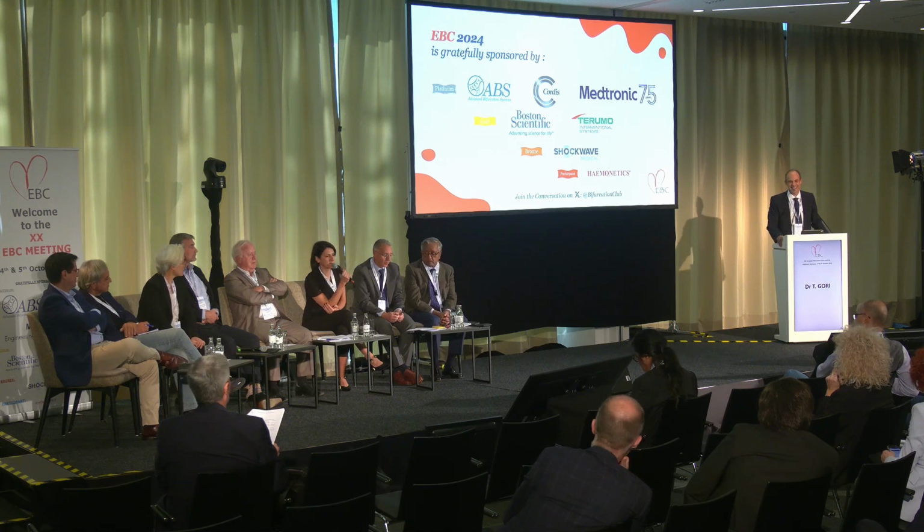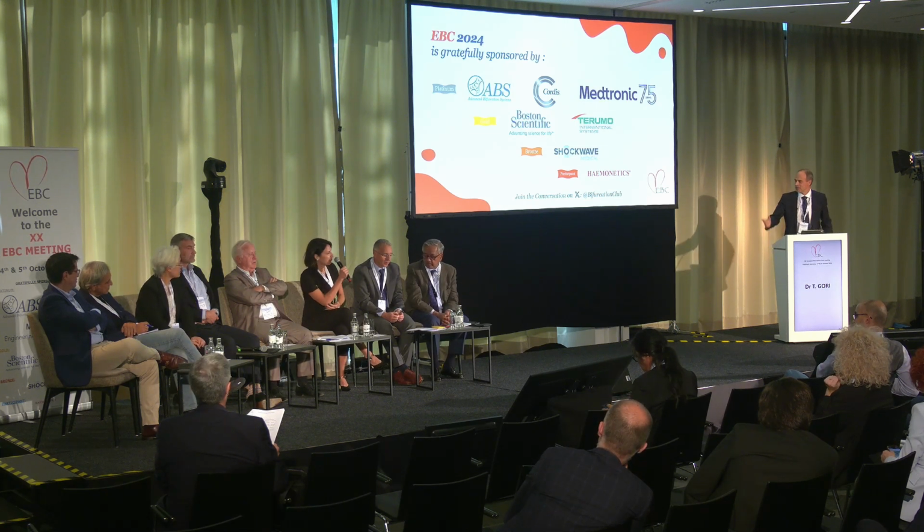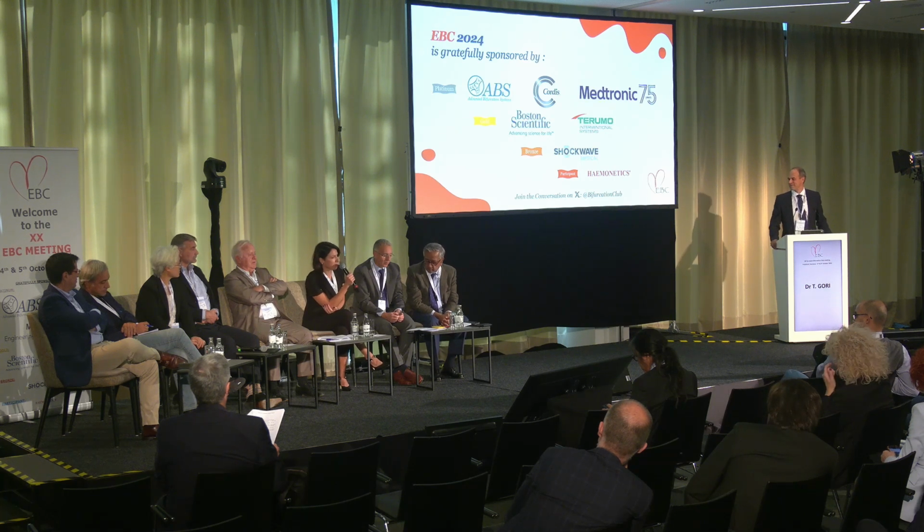Yes, and may I just say, it was an excellent presentation. My question is probably a comment, that the strategy is going to be determined according to the bifurcation angle, because this is the main point. If the angle is wider, then reverse TAP is much more convenient, and vice versa.